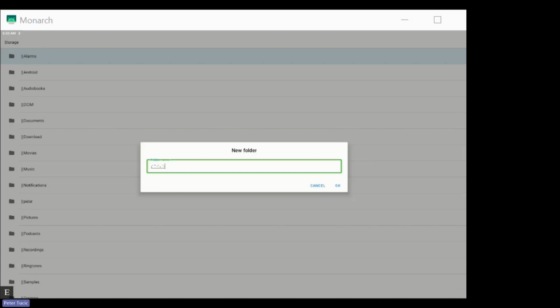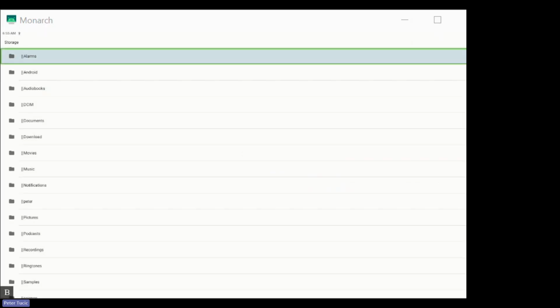So I'm using UEB contracted braille here. I type in SCI 56E as in science. I press enter and Science. Storage. Alarms. Now I have the word alarms. So again, it has that 8 dot full cell preceding it, meaning it's the alarms folder.